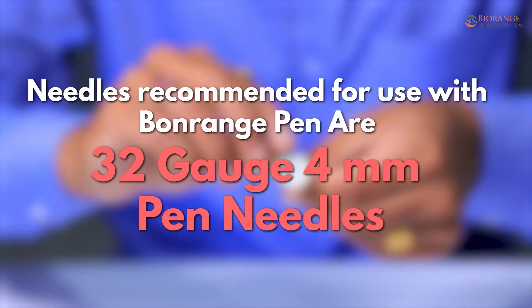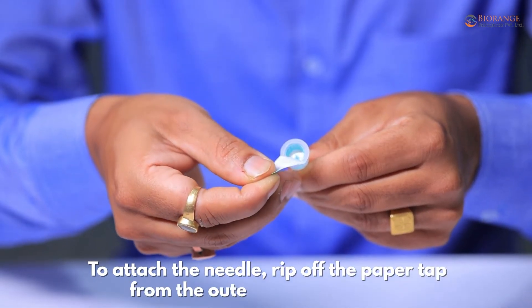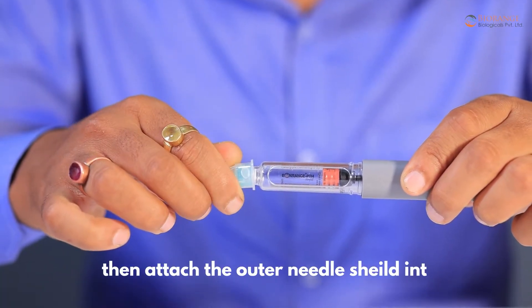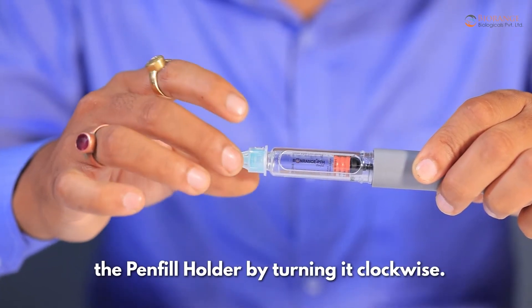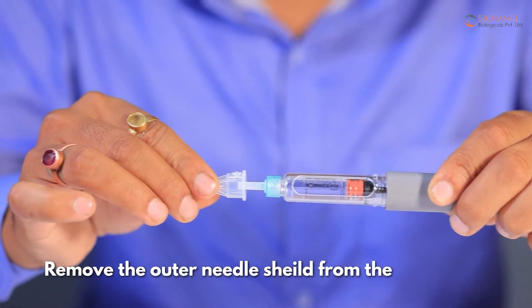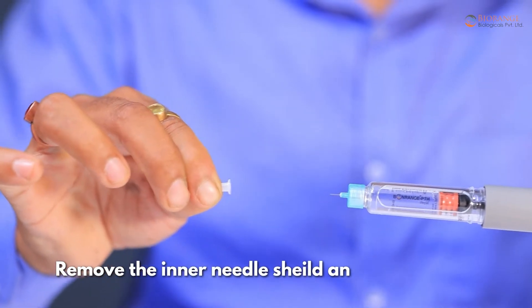Needles recommended for use with Bonrange Pen are 32 gauge 4 millimeter pen needles. To attach the needle, rip off the paper tab from the outer needle shield, then attach the outer needle shield into the pen fill holder by turning it clockwise. Remove the outer needle shield from the pen device, remove the inner needle shield, and place it aside.